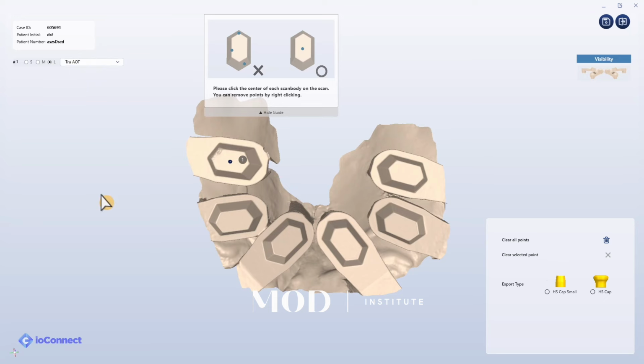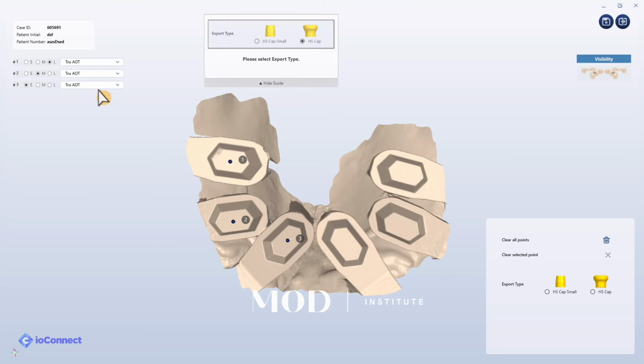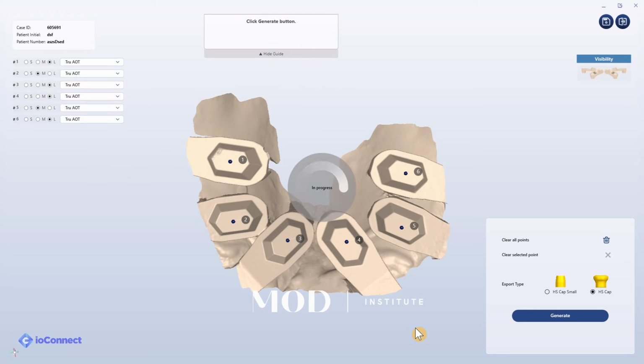You could open up ioConnect, which is TruAbutment's free software. And now you're going to use their software to find the implant positions for the MUAs. And so what you're going to do is click in the center of the hexagon, tell it whether you used a small, medium, or large scan body. Tell it whether you scanned with the mushroom-shaped caps or the dome-shaped caps for the soft tissue scan.